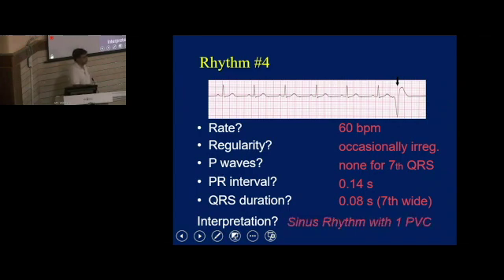Sinus rhythm with premature ventricular contraction. Like premature atrial contraction, this can be a premature ventricular contraction, with an abnormal QRS complex and no P wave at all, okay? There is some ectopic focus in the ventricle which generates the impulse and is conducted only to the ventricles. Obviously, it will not go to the atria.